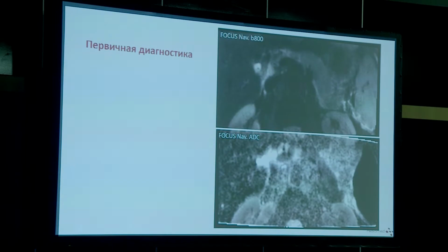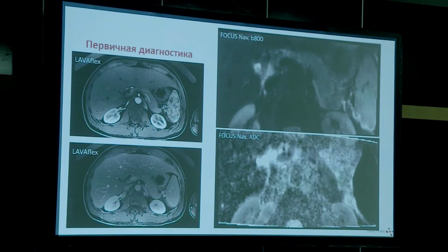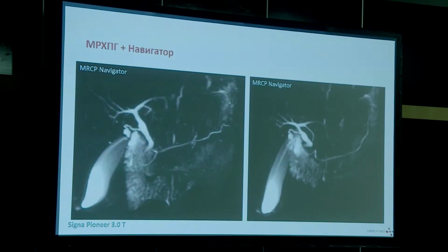The next slide shows respiratory triggered diffusion weighted imaging with navigator technique, focus B800, ADC, and contrast enhanced images. And so we added on the MRCP with navigator technique in order to exclude any stone or stenosis of the pancreatic duct. So quite good image quality in this patient with free breathing.